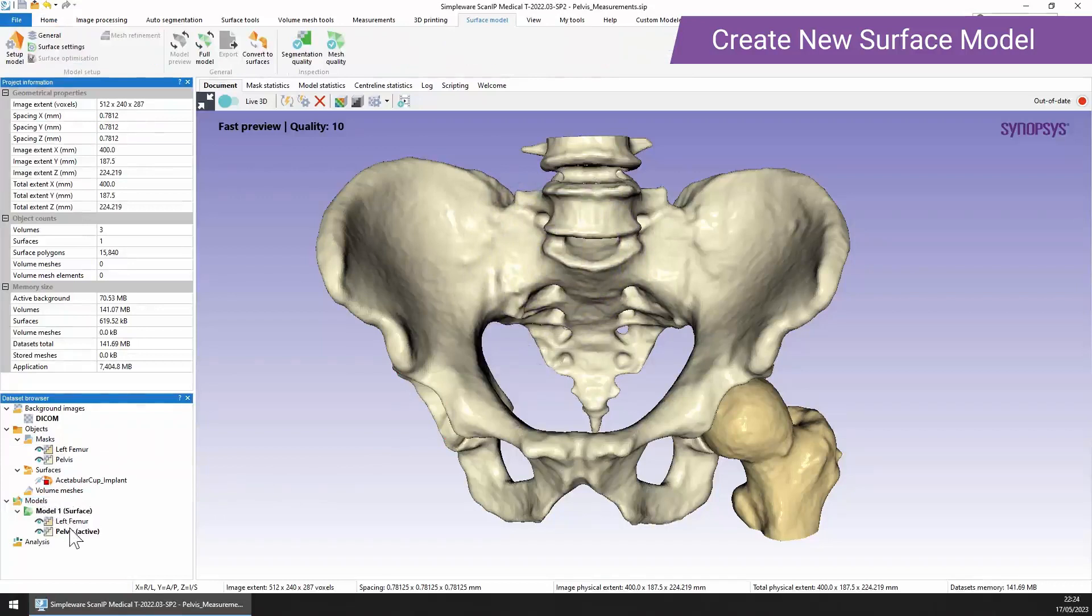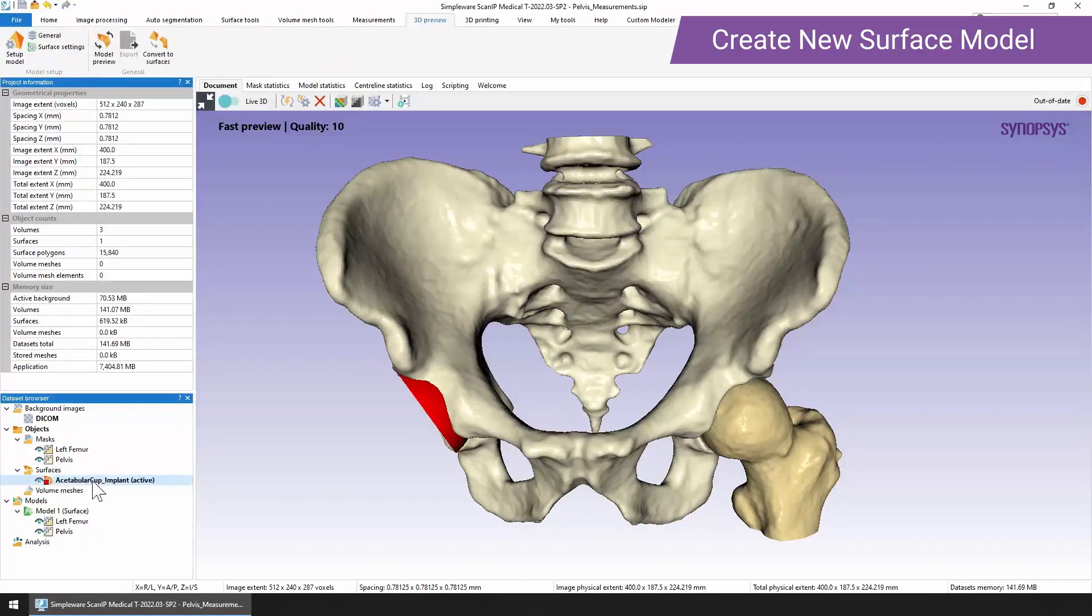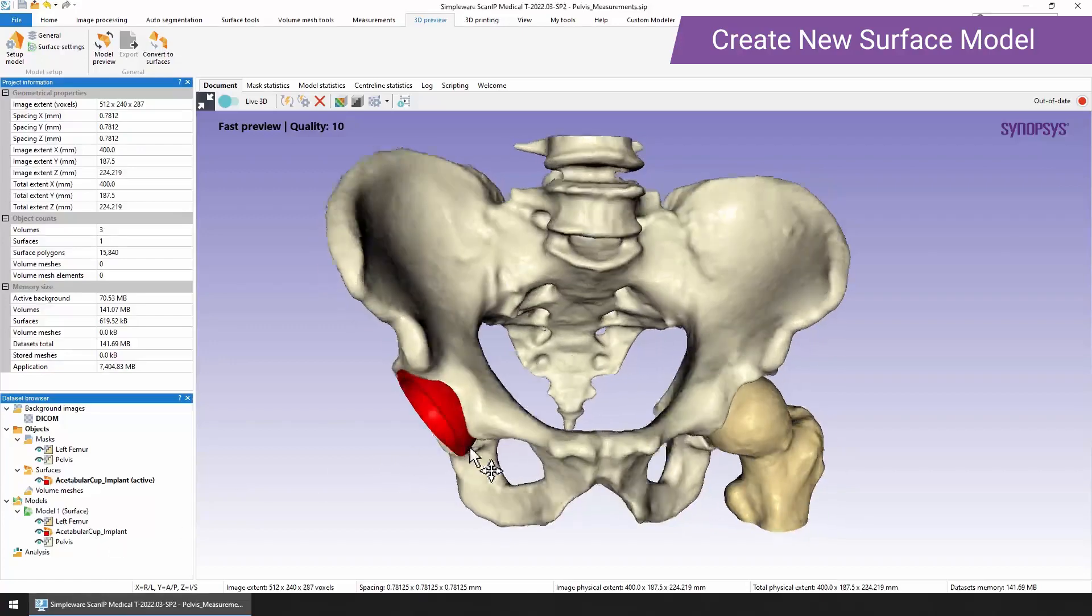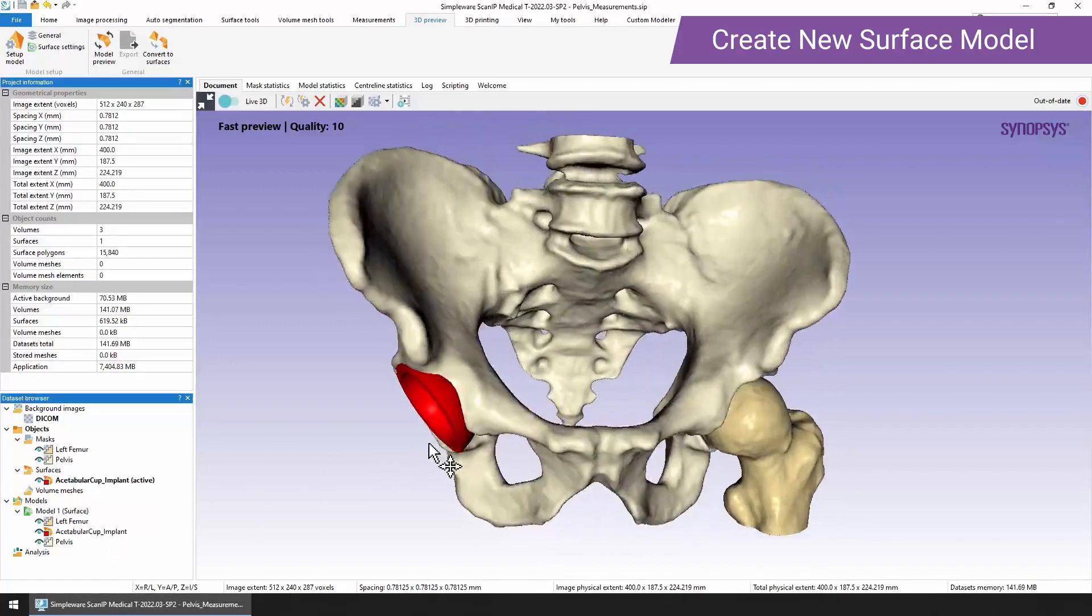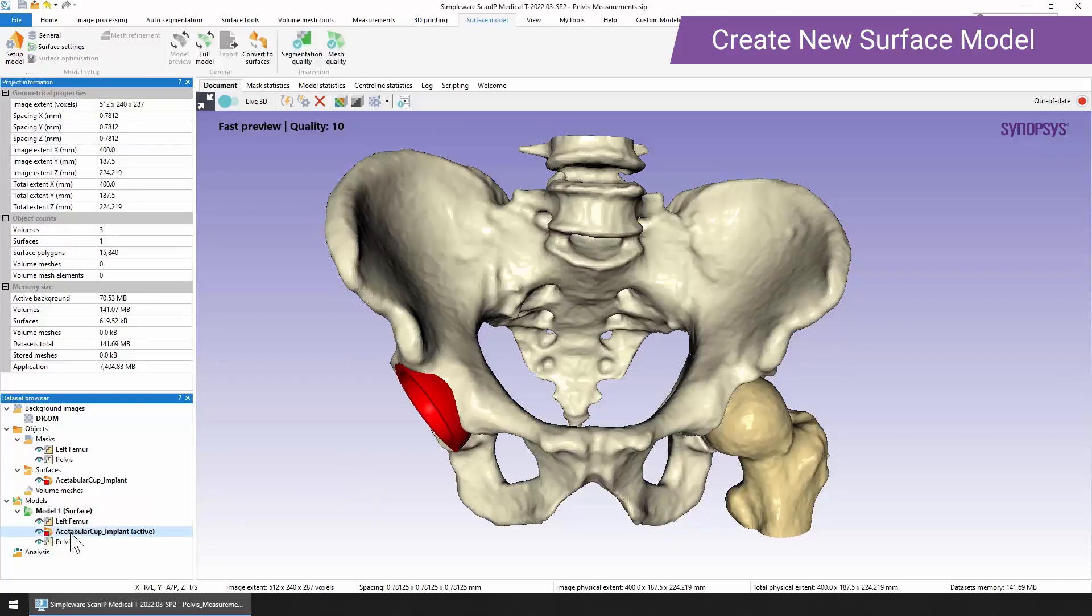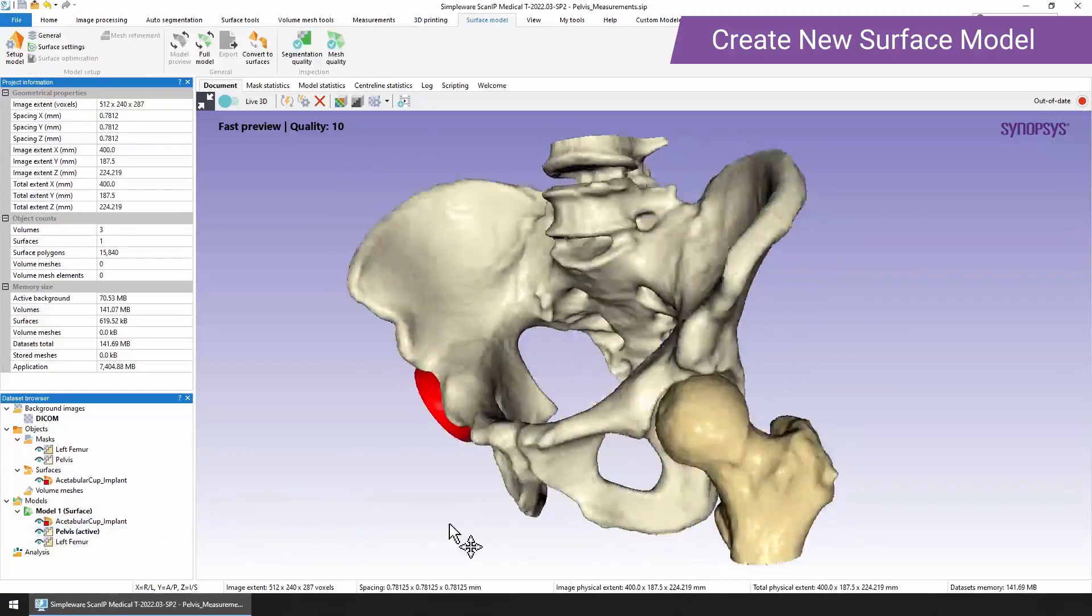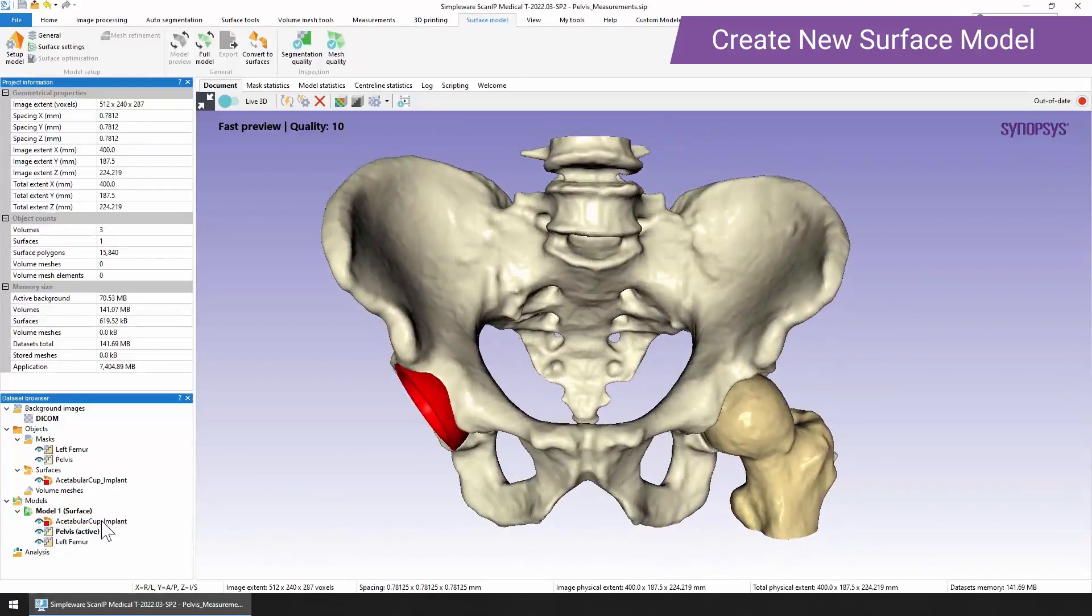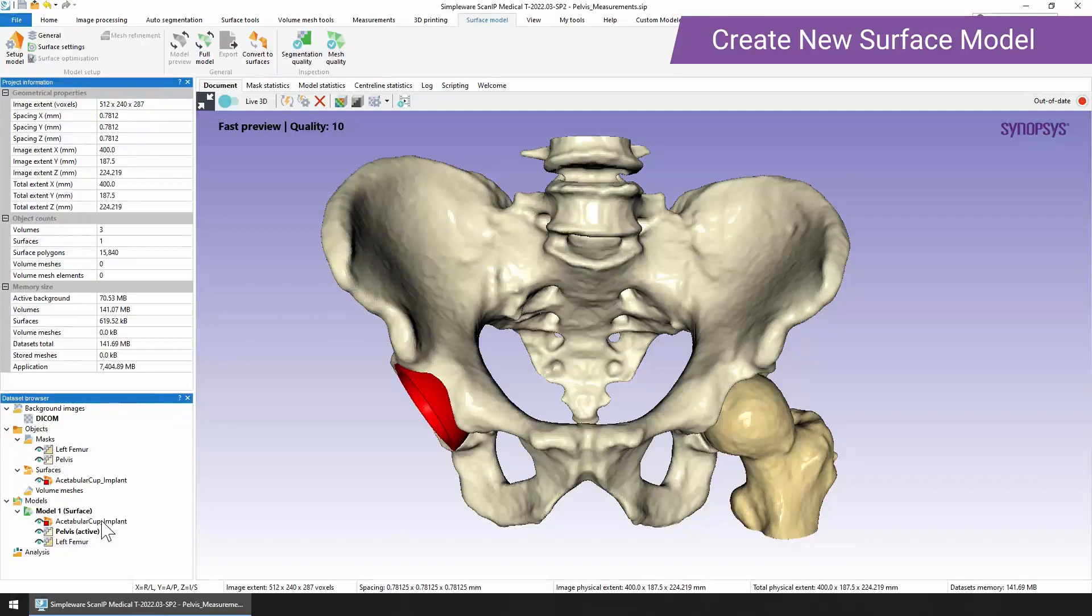One thing that is very important to note is that when you're adding different objects into a model, the order of these objects is important. In Simpleware ScanIP we use a priority system. The objects at the top of the list have priority over those lower down. In this case we need to make sure that the acetabular cup is above the pelvis, and the pelvis is also above the femur. Where the two objects overlap, the implant will take priority over the pelvis and the pelvis will take priority over the left femur.